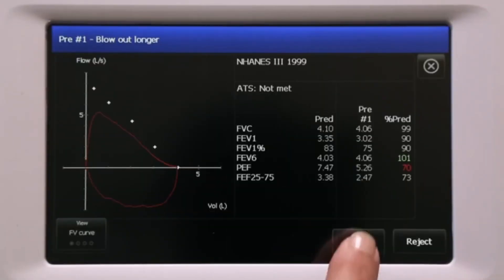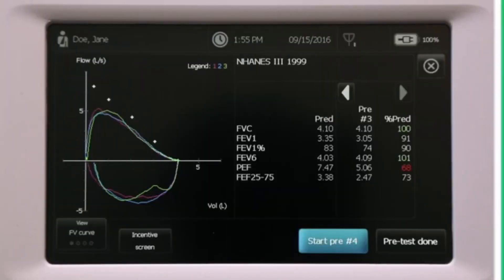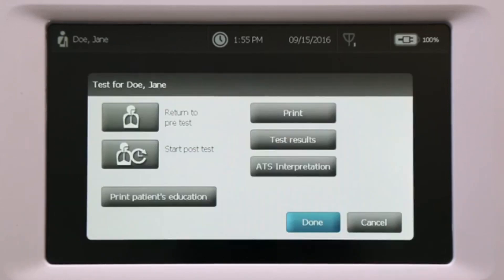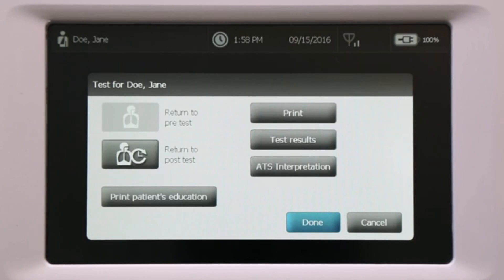Once the patient is ready, choose Start Pre Number One to start the spirometry test. Press Stop when the test has been completed, then touch Accept or Reject depending on the results. Once the patient has performed three acceptable maneuvers, touch Pre Test Done to complete the test. You can then choose to print the test report or start a post-test to perform post-medication efforts.